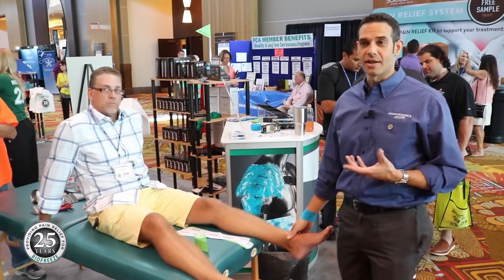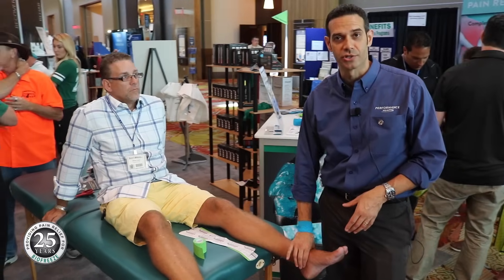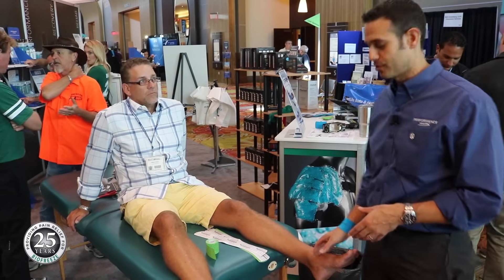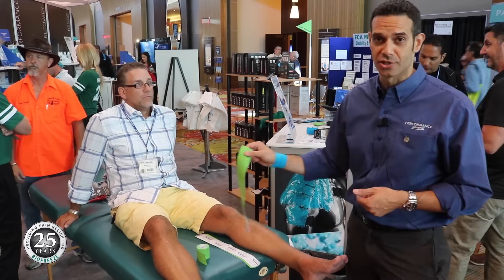At this point, a lot of the acute inflammation and swelling has gone down, but we're still having some problems with the ankle mortise joint. We're going to give him a tape job associated with stability for that ankle mortise and subtalar joint using four strips of kinesiology tape.